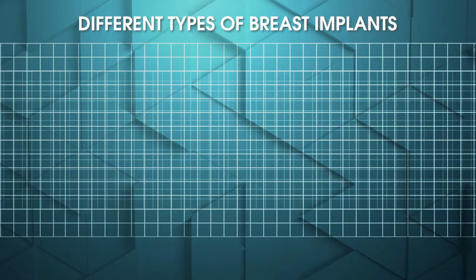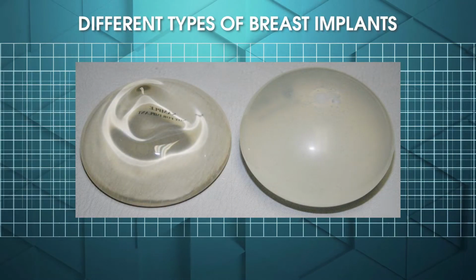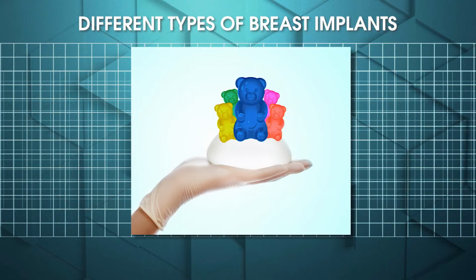Every single day, we're all in clinic and people are asking us questions about breast implants, and then they go on the internet and they get really confused. So our job is to find the real truth about breast implants. So let's talk about first fill, okay? Because we always get this saline versus silicone and the so-called gummy bear implant.